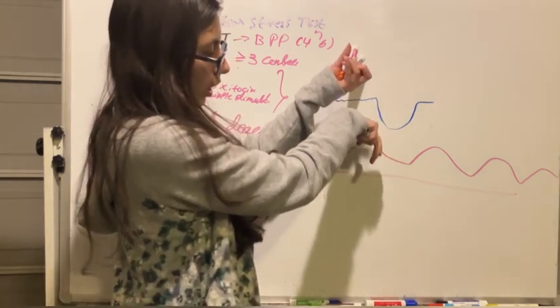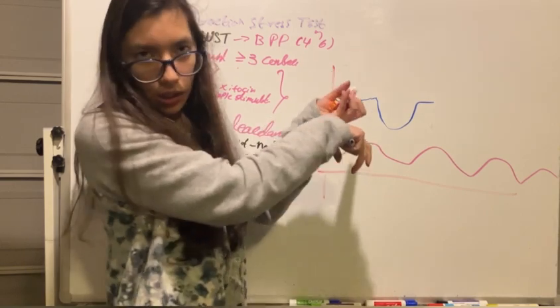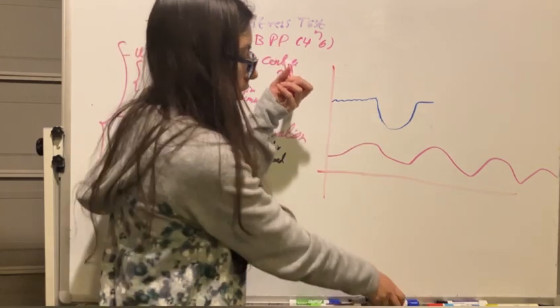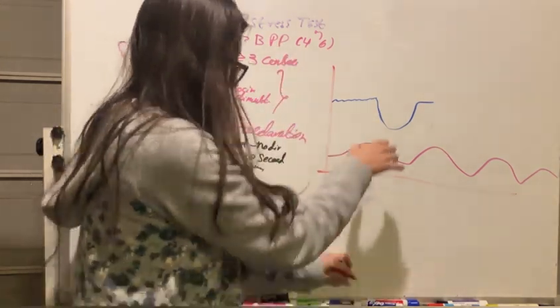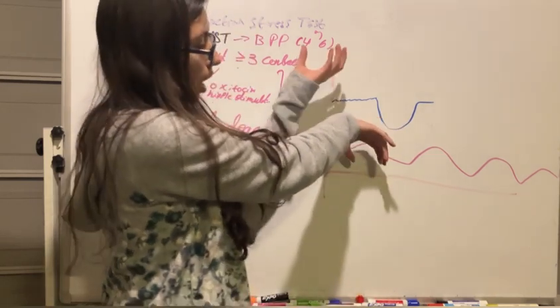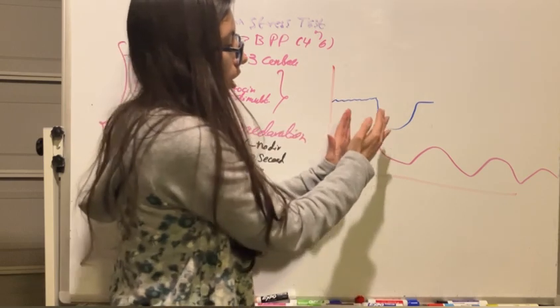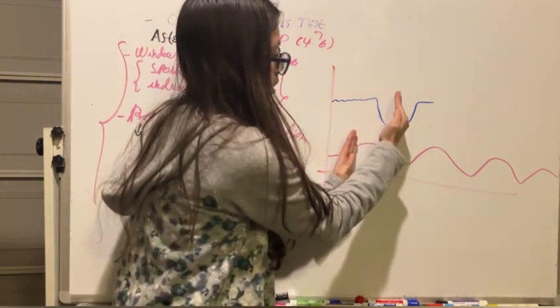So they are not in synchrony, they are not at the same time. That would be an early deceleration, and that would be okay. No, this is after a contraction. After a contraction, we have a delay in the deceleration. So these are not in phase, these are off phase.